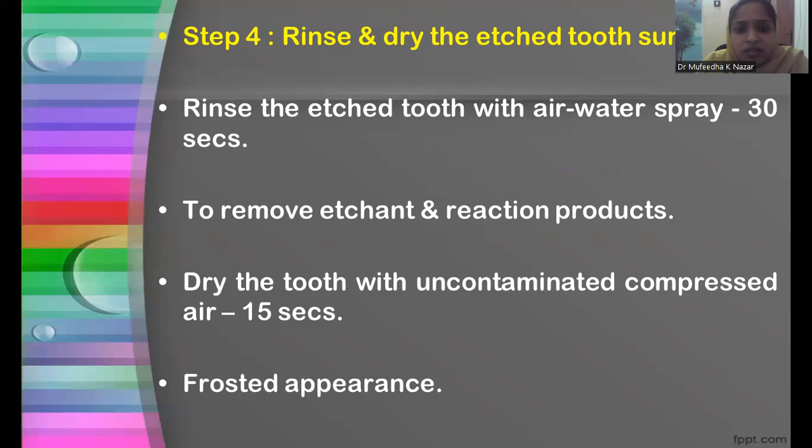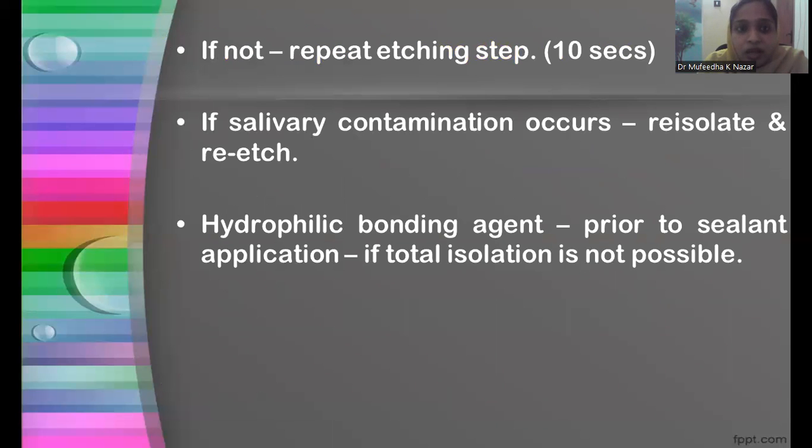After rinsing, dry the tooth with uncontaminated compressed air for 15 seconds and check for frosted appearance. If the frosted appearance is not seen, repeat the etching step for another 10 seconds. If the salivary contamination occurs, rinse the tooth and again re-etch.